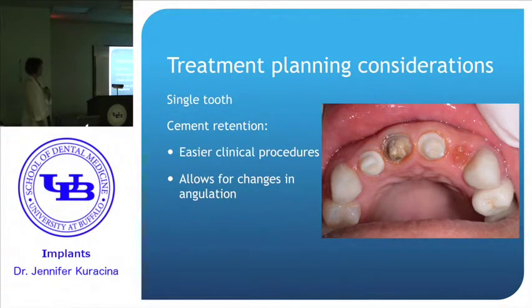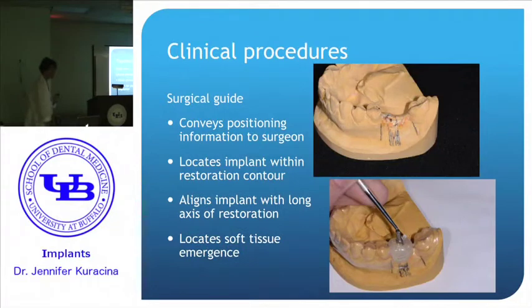We talk about cement retention as being what we typically do here, a lot more forgiving in terms of angulation of the implant, and sometimes more straightforward clinical procedures.